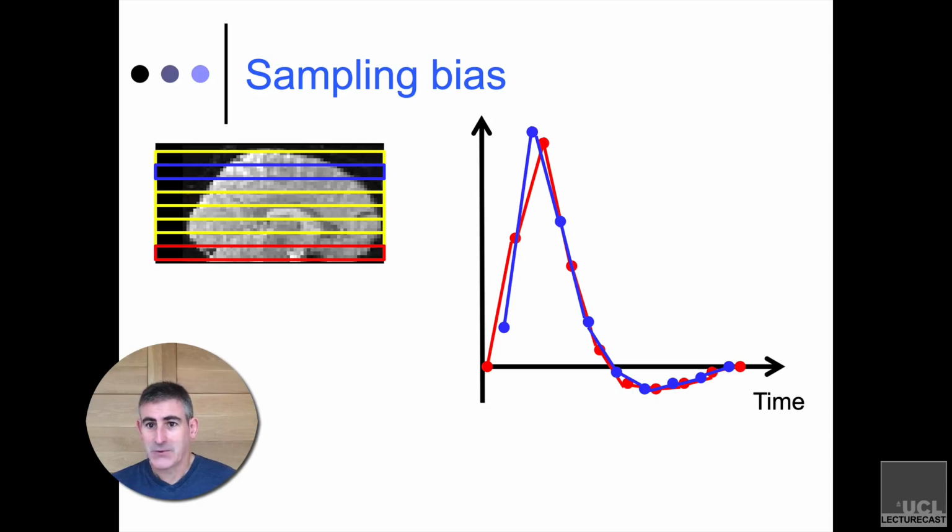And that formulation hopefully sounds incredibly familiar to what I said in previous videos, where we create a reference volume image in space and use that to estimate how much motion has happened, and then realign the data in order to minimize the effects of that motion. Well, that's the same problem that we're doing now in time rather than in space. We're going to take a reference slice and say that's our 0 point. Now everything is relative to that 0 point. Can we adjust this through interpolating the data so that it acts like we collected the data at this point in time?